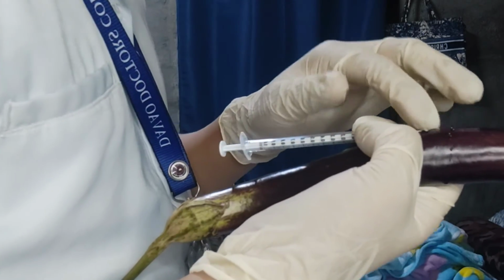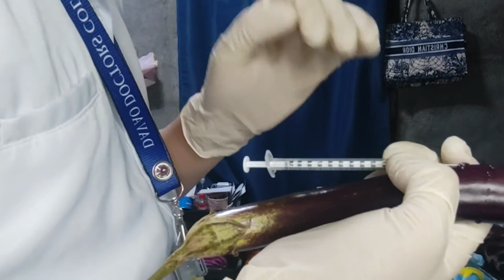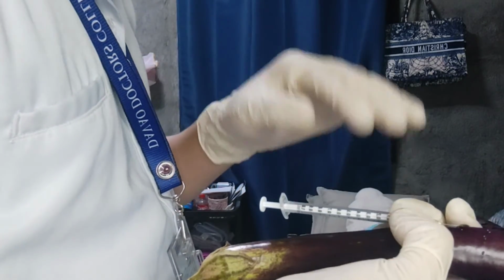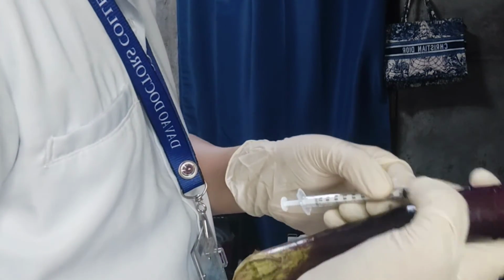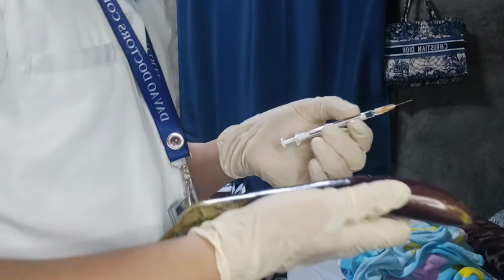As we can see, the medication has been withdrawn. Because we're not using the skin of a patient, we're just using an eggplant, we're going to withdraw the needle. Apply a bandage if indicated.